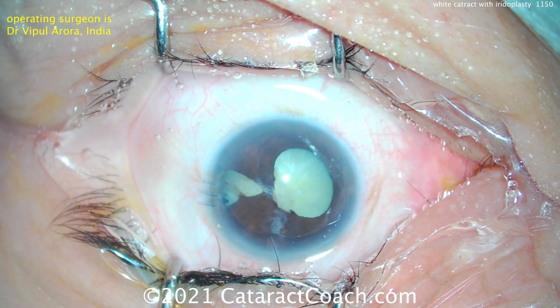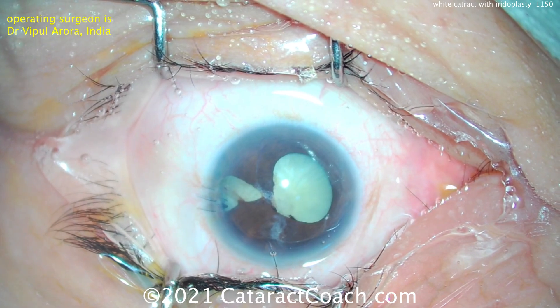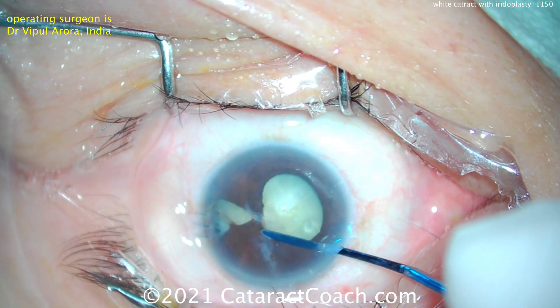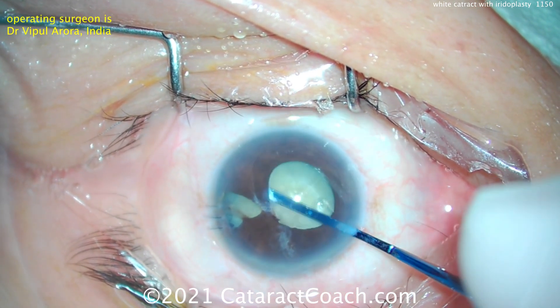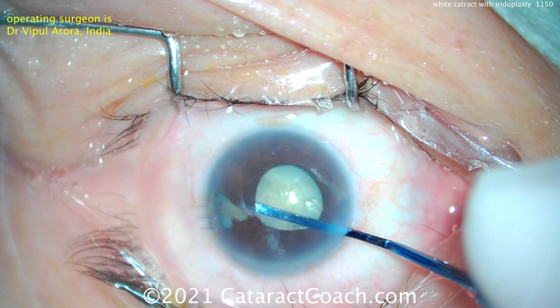This patient started to have cataract surgery with another surgeon who ran into a lot of complications — iris prolapse. You can see the sutures that are placed there temporally. The patient was then referred the next day to Dr. Arora to address this situation. So you can see we've got a challenge here on our hands.